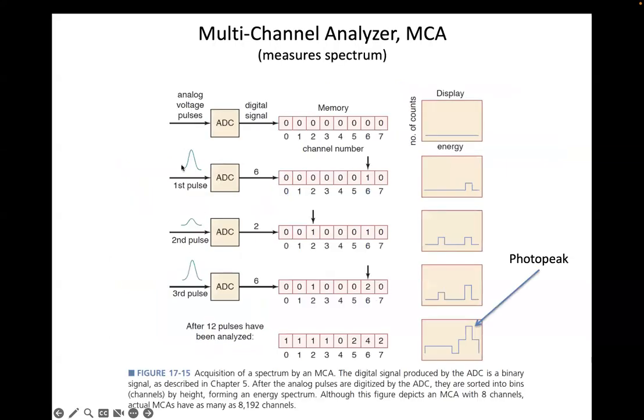So here we have these pulses coming in at a fairly good clip, right? Because the number of photons that are produced per second by the contrast agent you put into the patient can be pretty high. And so a lot of these pulses are coming through. Sorry, the analog to digital converter also knows which detector the signal is from. And so if the pulse height analyzer says, yep, it's in the right range, it'll put a tick at that box and record it as a signal. And so this is done over and over again, and you just fill up. This is just a 1D array, but you can imagine you have a 2D array for this, where you fill up a sort of intensity of detection here.